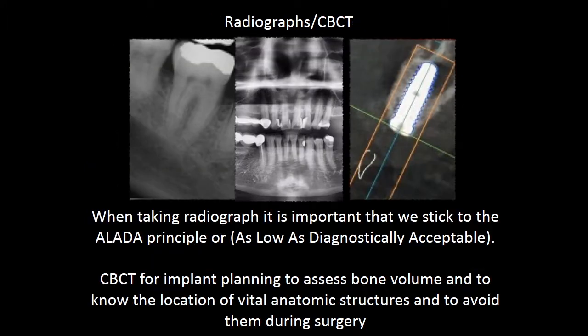We take radiographs to help us with diagnosis, to monitor the disease progress, and also for assessment of the outcome of treatment. When taking radiographs, it is important that we stick to the ALADA principle, or as low as diagnostically acceptable. This means choosing the type of radiograph that will yield the most information and at the same time keeping the dose of radiation to as low as possible for the patient.